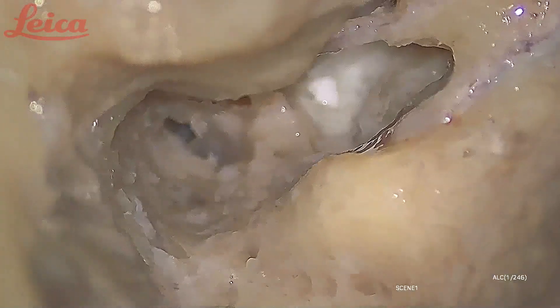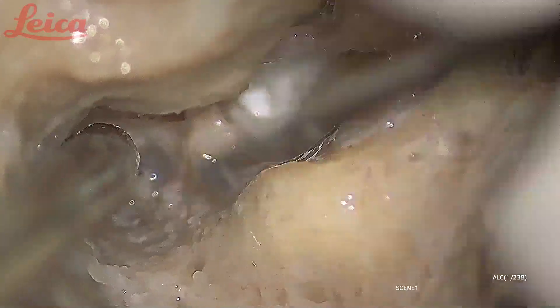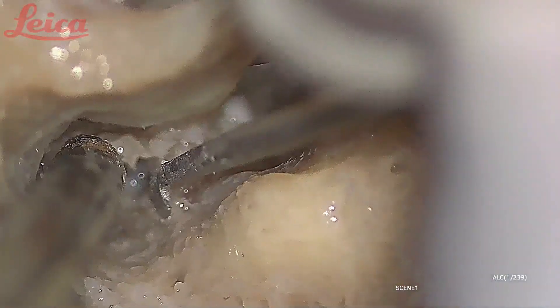The best way to identify the geniculate ganglion is to fracture the process cochleariformis. I am going to keep this instrument at the base of the process cochleariformis and lift it up. When you lift it up, the process cochleariformis goes away — this is the tensor muscle which was attached here. Whatever soft tissue comes into view here is the geniculate ganglion. This bone was covering the geniculate ganglion; I just fractured it.